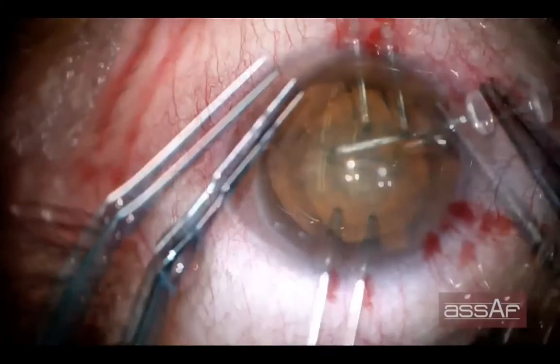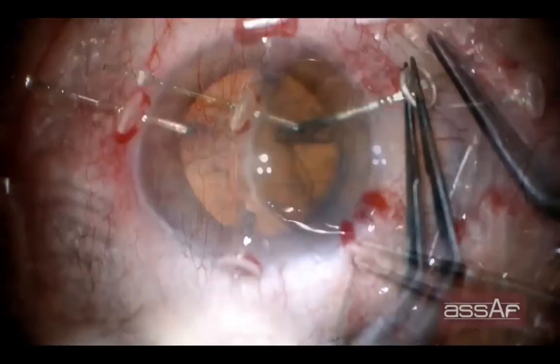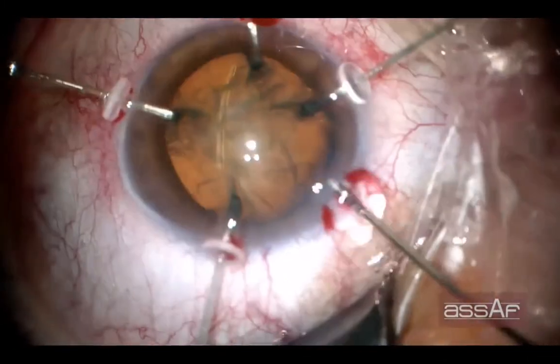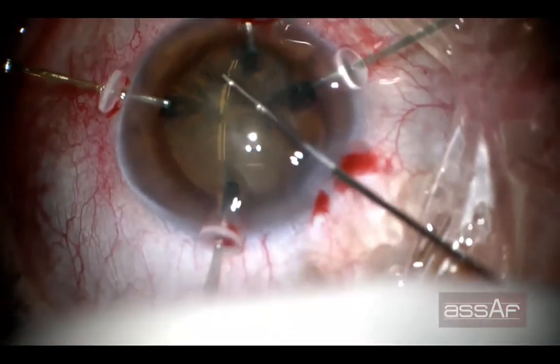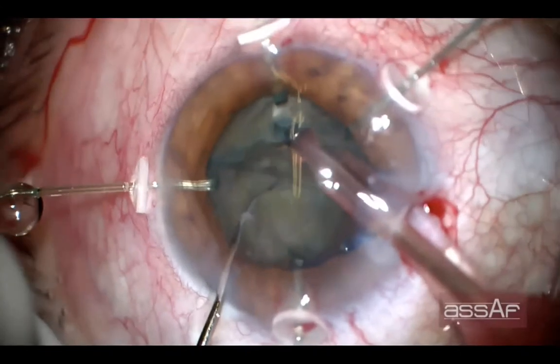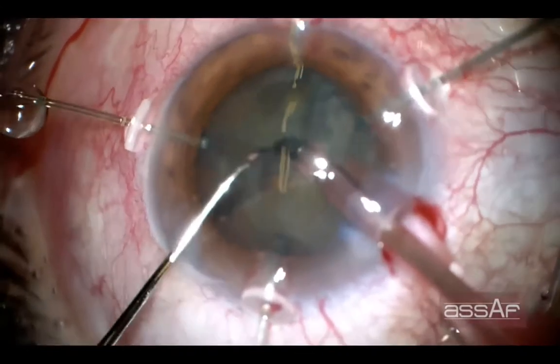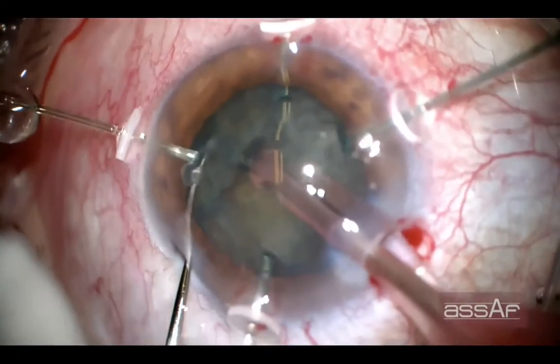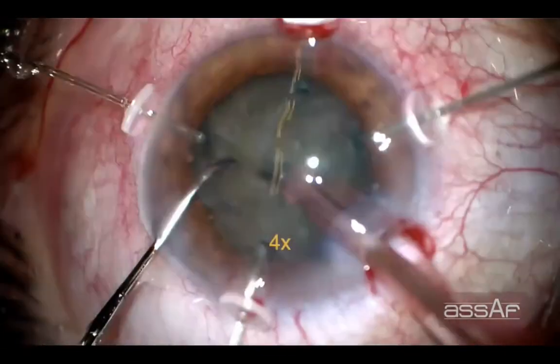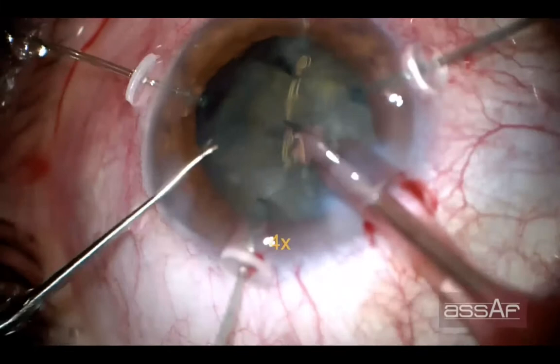Those capsular support systems are similar to iris hooks, but they are more gentle on the lens capsule, especially in the fornix area, because of the large broad ends. So I prefer this system over the iris hooks to support the lens capsule during phacoemulsification, and I would like to name them artificial zonules because they keep the lens in place, especially in the vertical orientation, so we can continue phacoemulsification in the usual way.